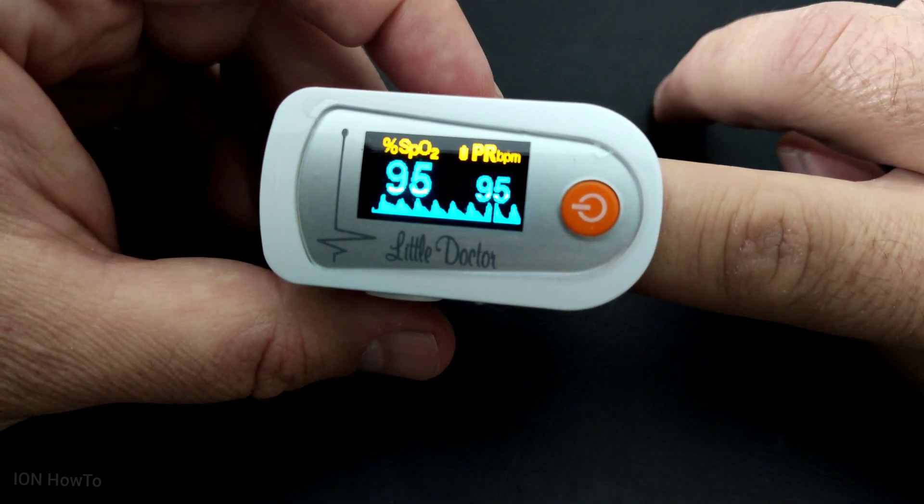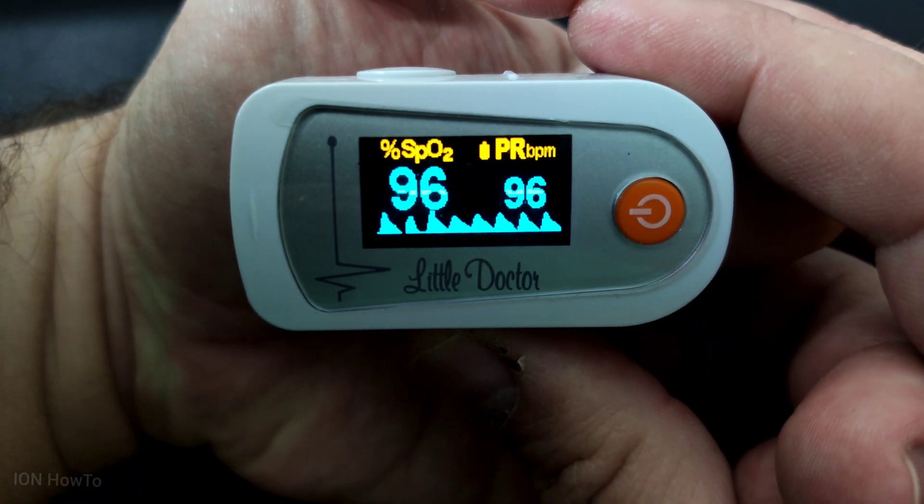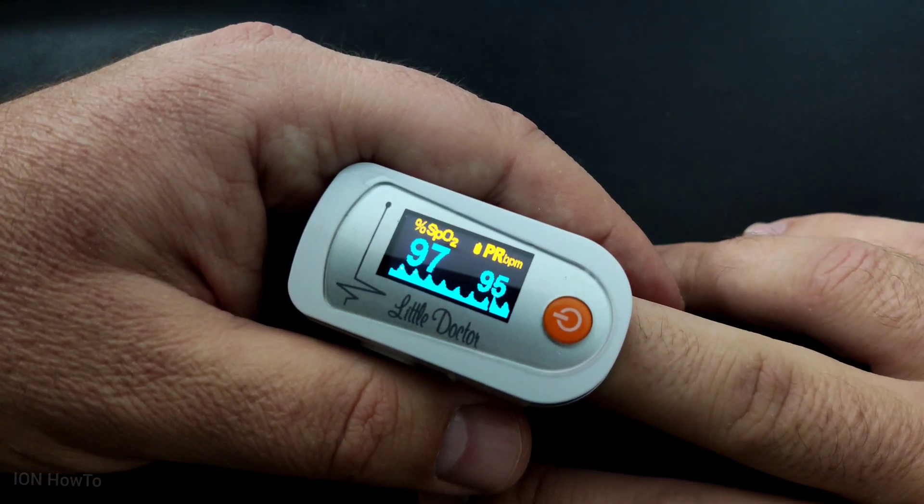So this is how it works: you put your finger in and it will show you the oxygen measurement and your pulse. Anything below 95 is bad.